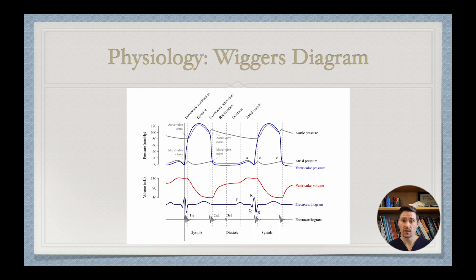Now, don't worry about memorizing this diagram. This is not something I suggest you memorize. I just gave you this diagram to look at, think about what's going on when you have a PQRST happening right in front of you while you're in a clinical setting.